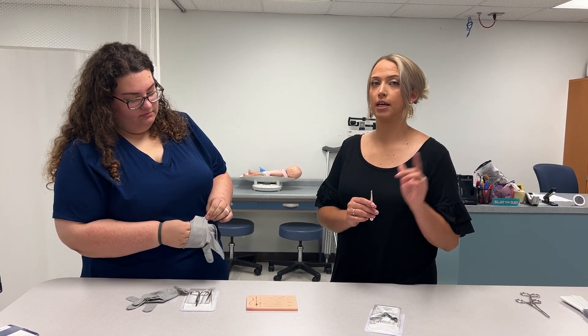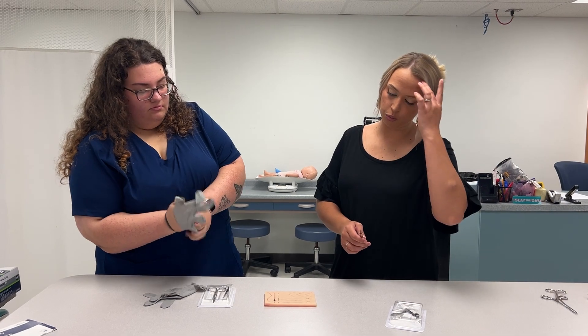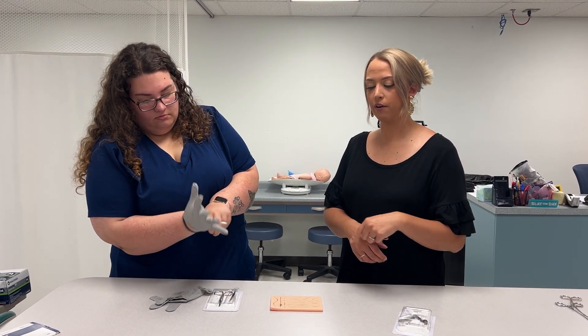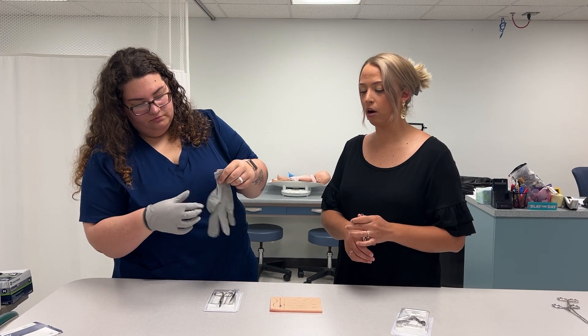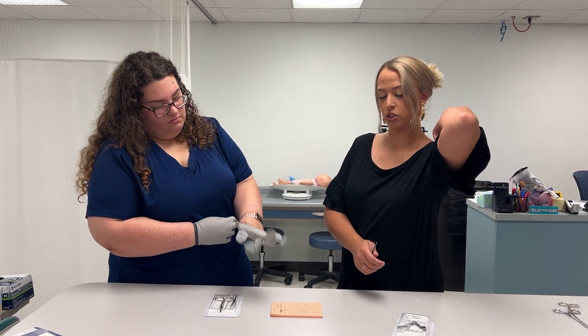Today we are going to take out some stitches. This patient has three stitches — we've already verified our patient and had the doctor come and verify that the stitches are ready to come out. The wound has actually started to close, so we are good to take the stitches out.